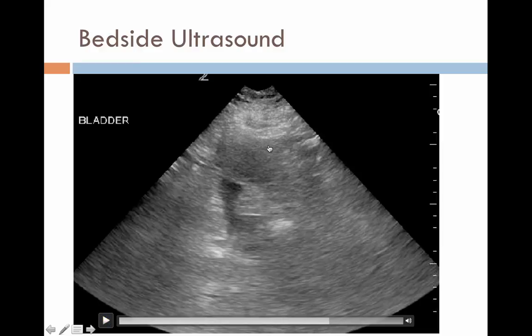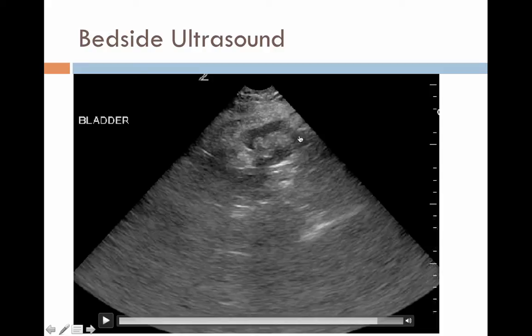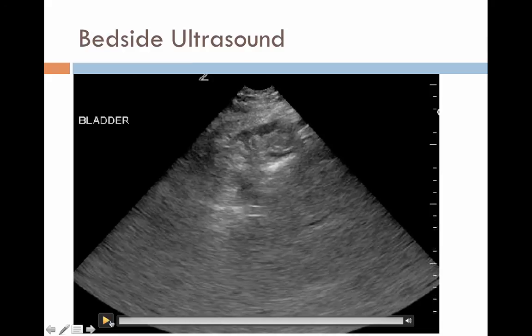And then here we're back. We just scanned through the bladder, and again we're towards the uterine fundus. We see again fluid in this patient's pelvis. And then right here towards the end, take a look at this. This is again right around the pelvis. We've just scanned up through the bladder and the uterus. And what we see here is we see intestine. So if you remember anything else from this case, it's anytime you see intestine on a FAST exam, start looking closer, because there's probably some fluid there that's making that intestine more visible. Because usually we can't really see the outlines of intestine on a FAST exam. But we definitely see intestine that is outlined with fluid here in this patient's pelvis.